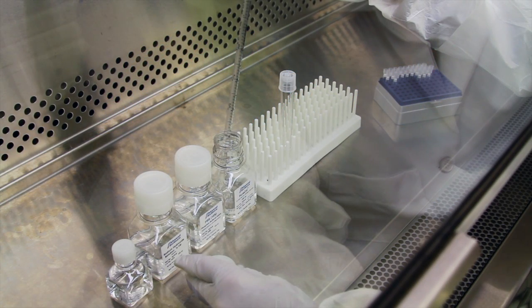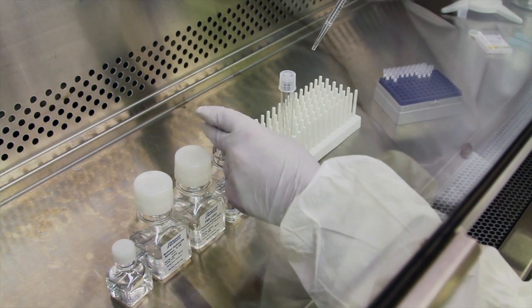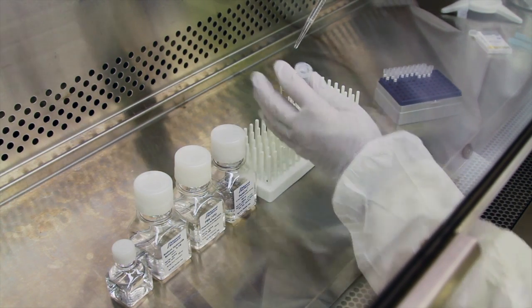To start, dispense 8 parts of the chilled collagen solution into the test tube. In this example, pipette 4 ml of collagen into a sterile test tube.